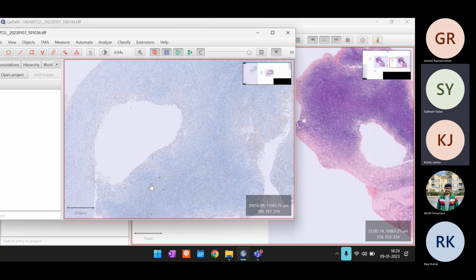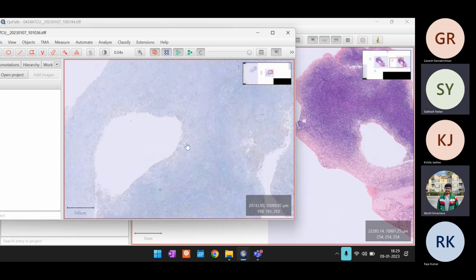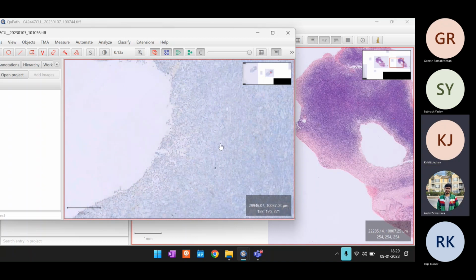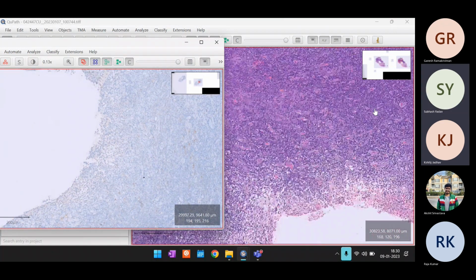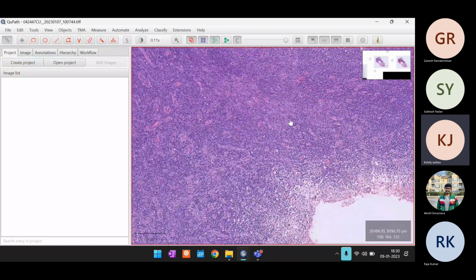Akshit, can you identify RS cells in the HNE? In the CD30, right? No, in the HNE. Oh, actually, sorry, Subhash, we are not even trying to look at RS cells in the HNE. What we are trying to do is identify the RS cells from the CD30 image, and then through location overlap, we want to just take them off. That is what we want to do.